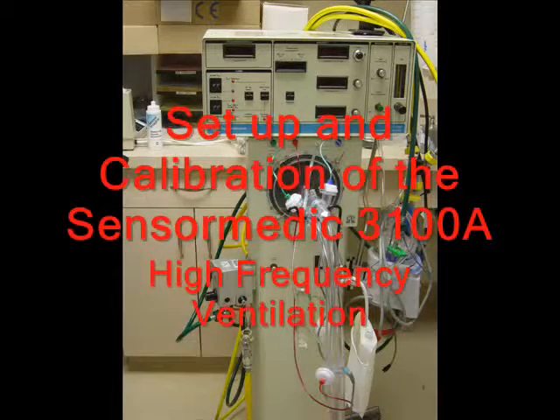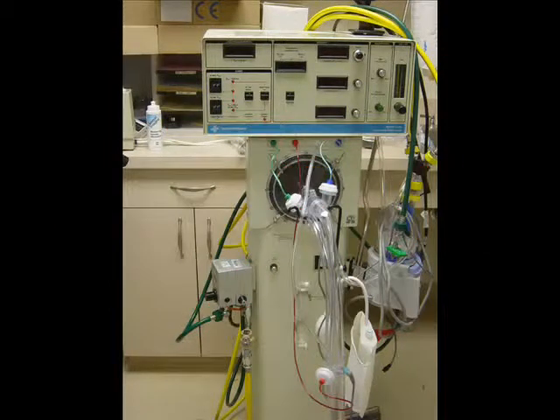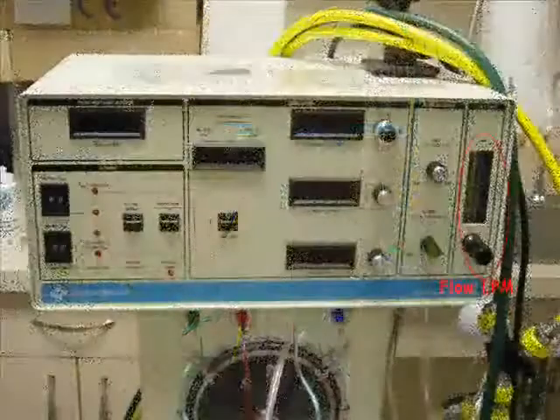Welcome to the setup and calibration of the Sensormedic 3100A. This is a high frequency ventilator which is used most frequently in neonatal. Now let's take a look at some of the controls.